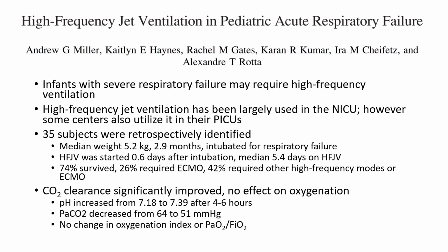And we're going to end with 3 papers on high-frequency jet ventilation from our group. As we know, infants with severe respiratory failure may require high-frequency ventilation for a variety of reasons. High-frequency jet ventilation has been used quite a bit in the NICU setting, but there are some centers that use it in the PICU, but it's not widely used, and there wasn't very much published. So we did a retrospective review. We were able to enroll 35 subjects. Their median weight was 5.2 kilos, 2.9 months old, mostly intubated for respiratory failure.